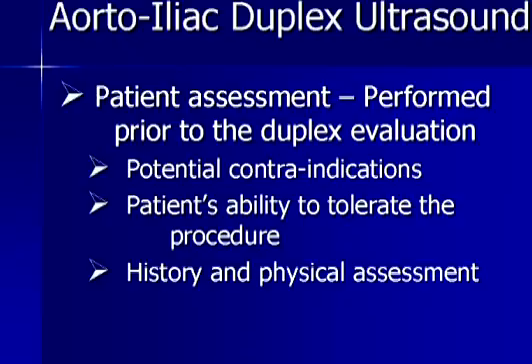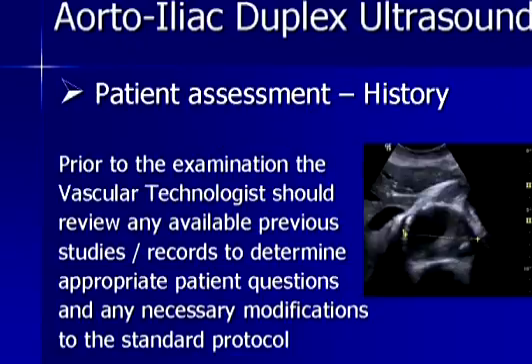Also, a relevant history and physical assessment should be done. Of very much importance is your ability, if possible, to review any previous imaging studies that may have been done, be it ultrasound, CT, MR, angiography, any type of imaging study that might be available for you to look through the patient record, as well as any operative notes or previous clinical visits the patient might have had, so you have a complete history available and you know what it is you're looking for. This will aid immensely as you adapt your standard protocol to a specific patient's condition.